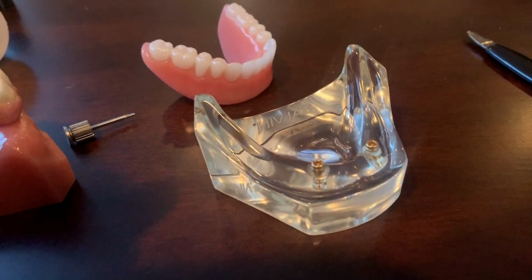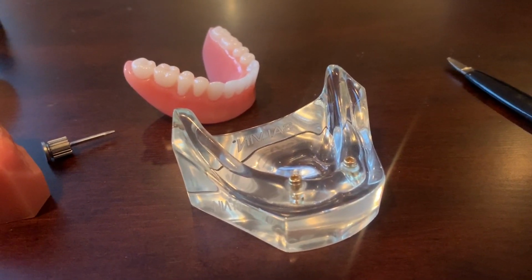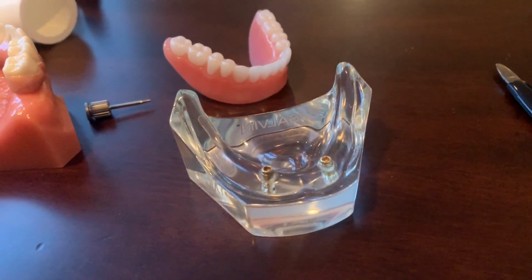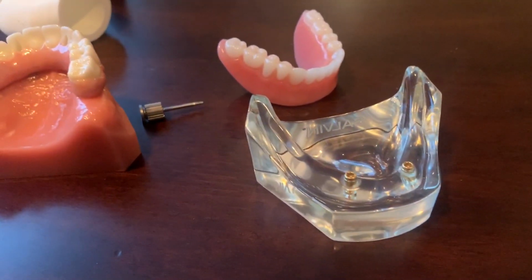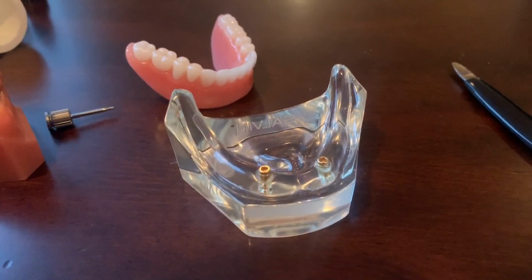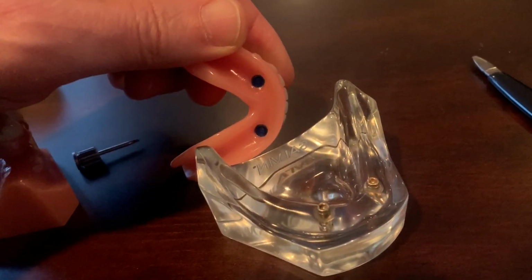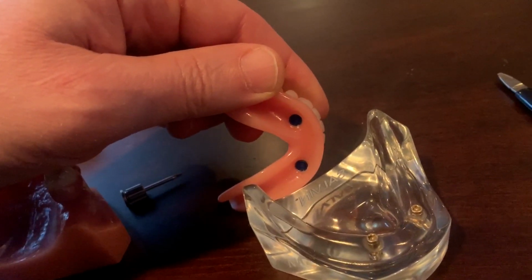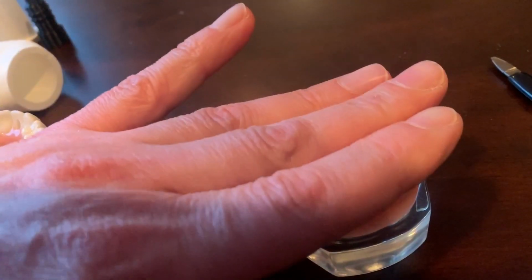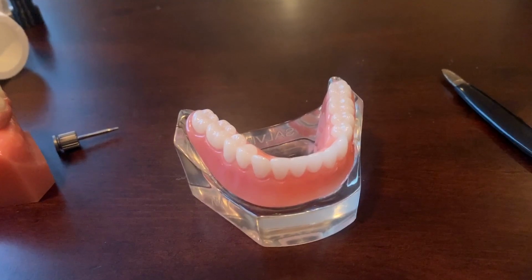This is the removable denture. I was telling you before that there are little snap-on attachments. In this particular case, it's a lower set, and this particular model shows 2 implants. You can also have 4 implants where there's 2 more in the back to make this a little more stable. But the way this works is, if you look at the underside of here, there are the female side, which literally snaps on, and those have gotten the name on the street, snap-on dentures.